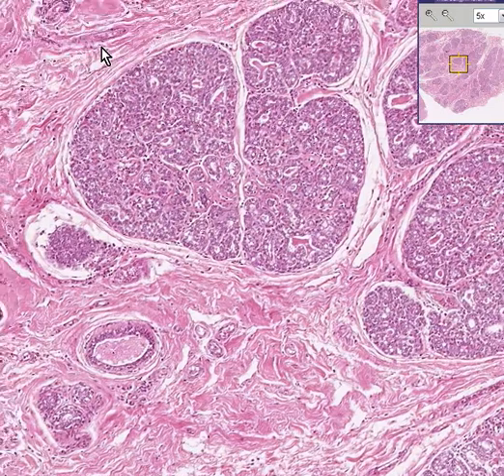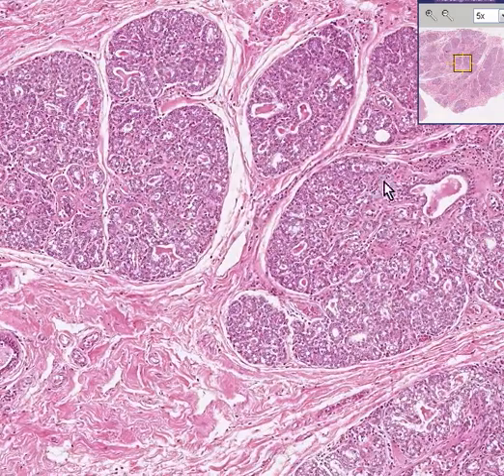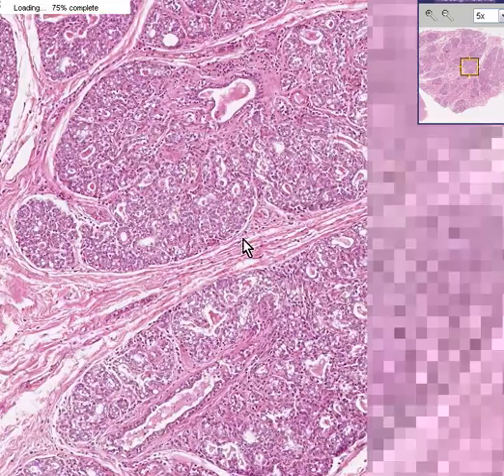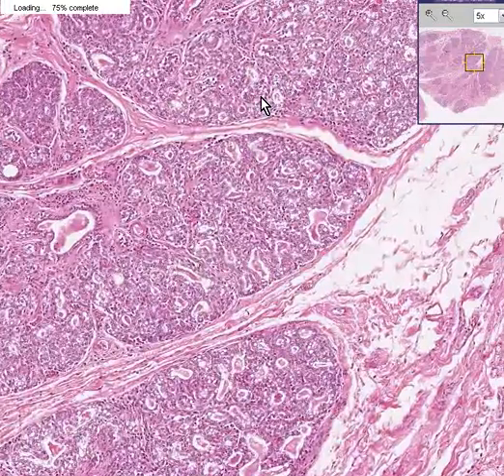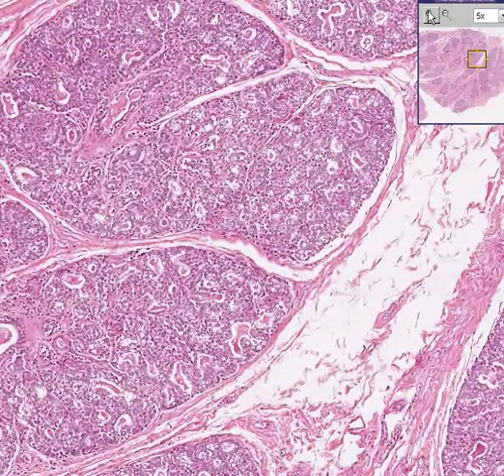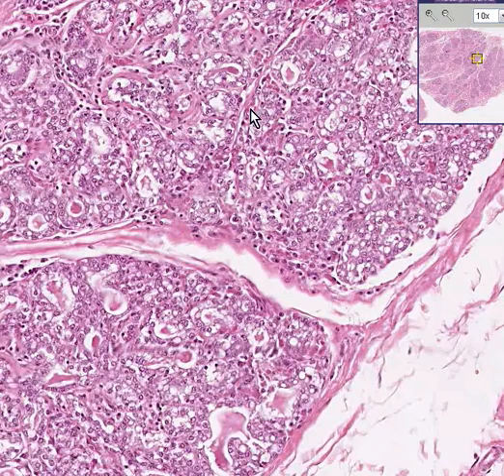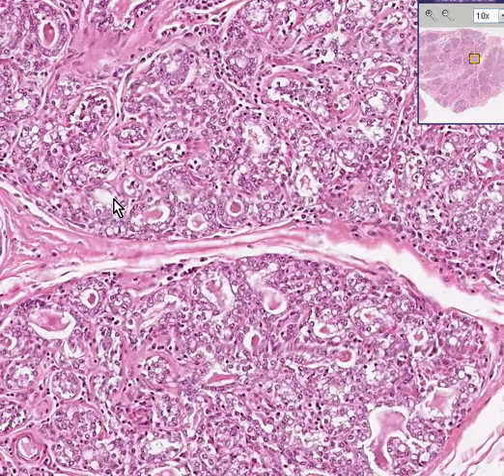And you could see here that there is probably more by way of glandular lobules than there is stromal connective tissue. So this is totally consistent with hyperplasia, which is a normal type of hyperplasia of pregnancy. Also notice that there is very little by way of secreted milk material within these acini. There may be a little bit, but for the most part they're not distended like thyroid follicles with milk.